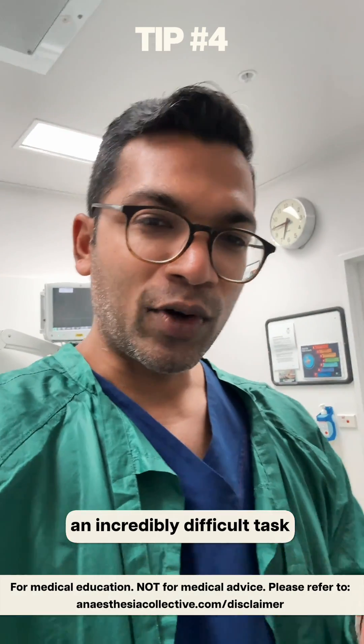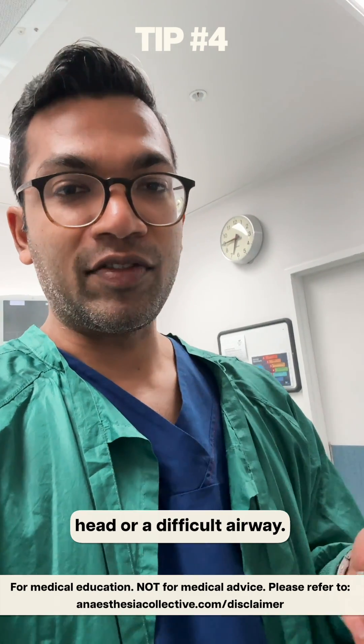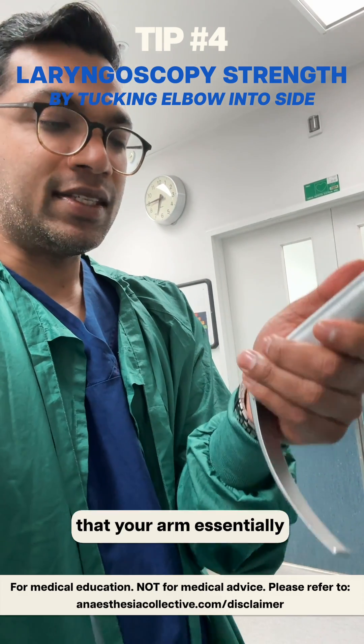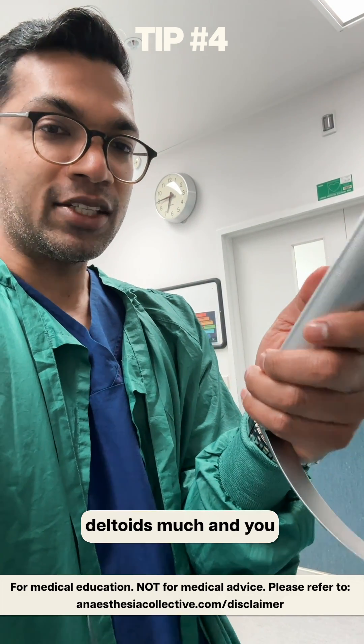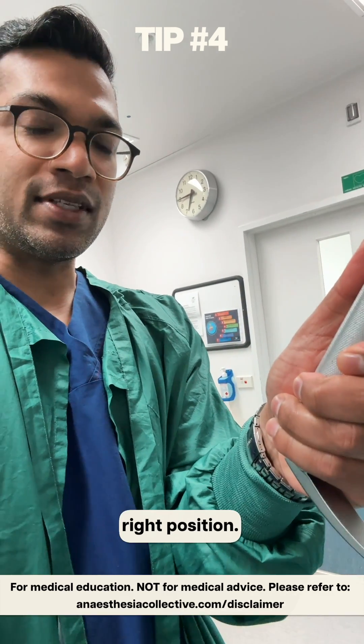Laryngoscopy can be an incredibly difficult task, especially if your patient has a heavy head or a difficult airway. I encourage keeping your elbow next to your body, which means your arm essentially doesn't have to move much. You're not using your deltoids much, and you can really focus on keeping this angle and action in the right position.